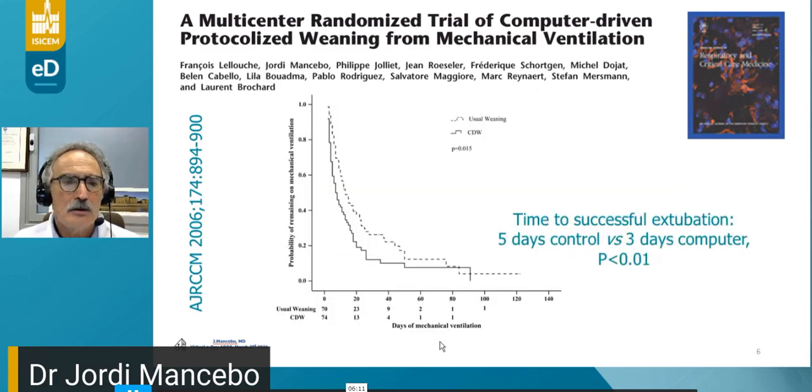Here you can see that when this computer-driven strategy was compared to the usual weaning strategy, the time to successful extubation was significantly shorter, 3 days versus 5 days, in the computer-driven system.